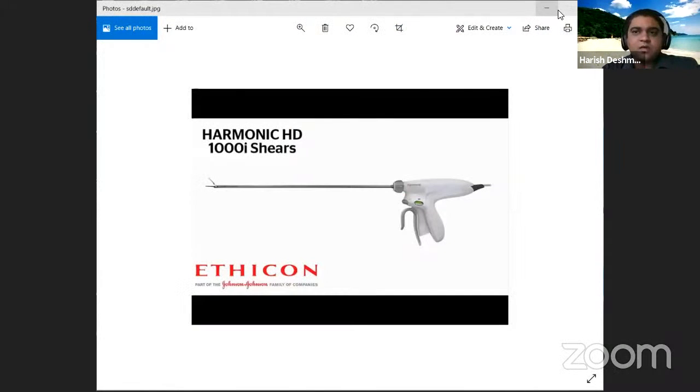No, harmonic is not indicated for any ducts basically. It can be used, but it is not recommended or prescribed to cut any duct. But you can always use it for vessels up to 5 mm when you are using regular harmonic. But in case of this device, the HD1000i, which is the latest in the market basically.